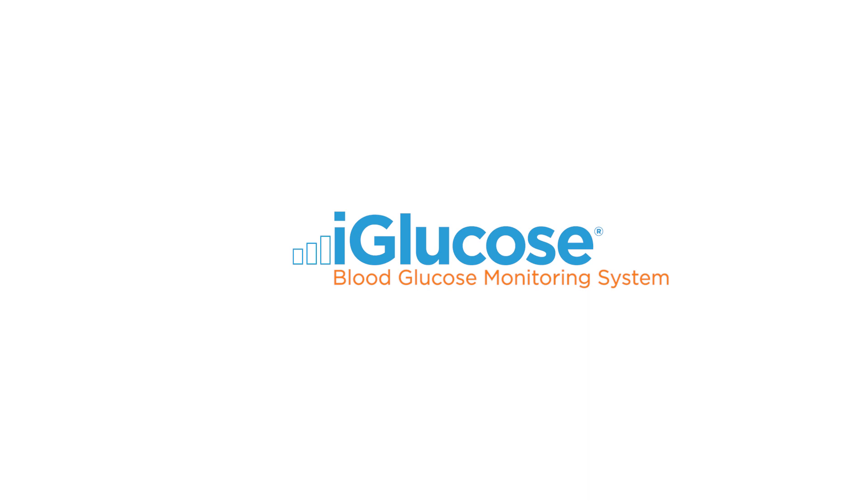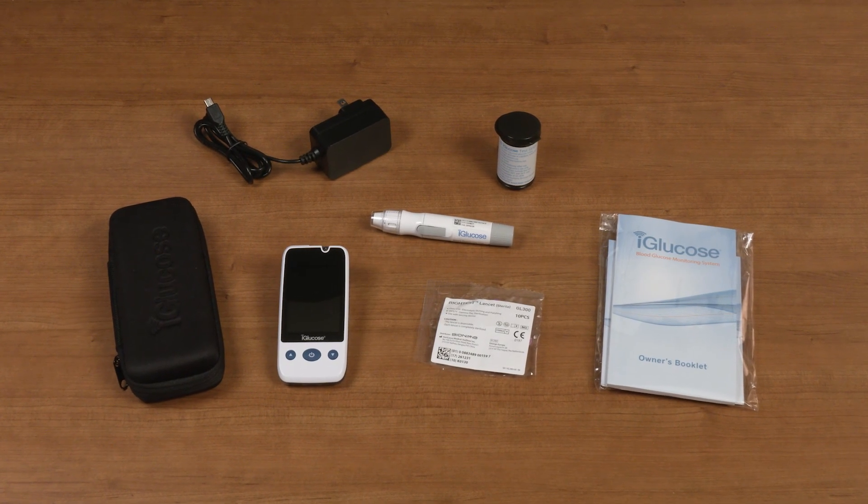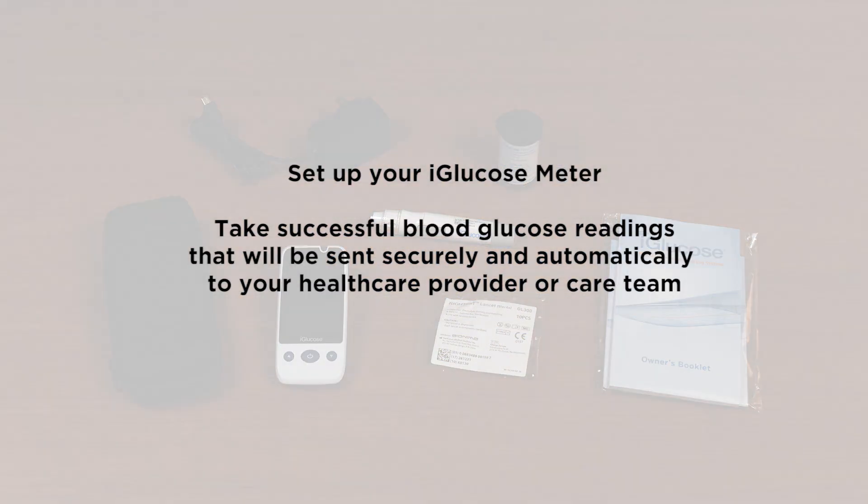Welcome to the iGlucose Blood Glucose Monitoring System, a cellular connected glucose monitor to help make managing diabetes simpler. In this video, we will cover a number of topics that will help you set up your iGlucose Meter and take successful blood glucose readings that will be sent securely and automatically to your health care provider or care team.